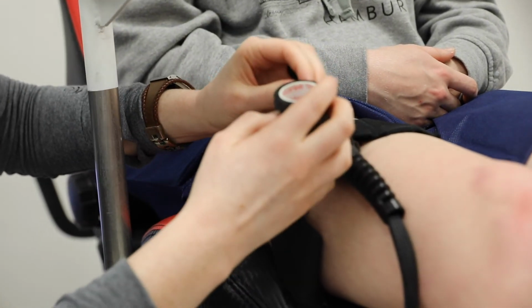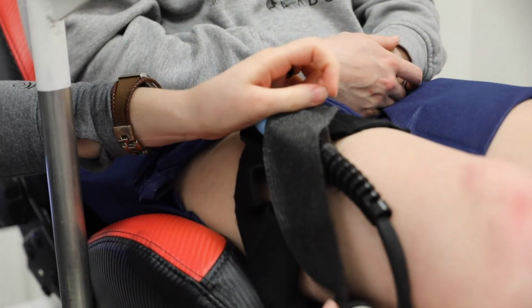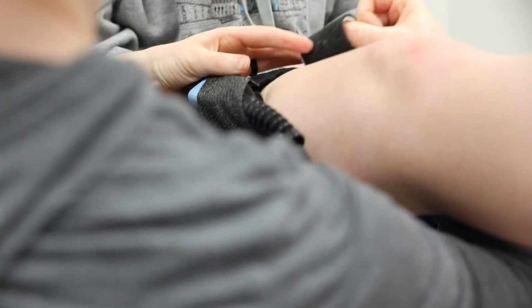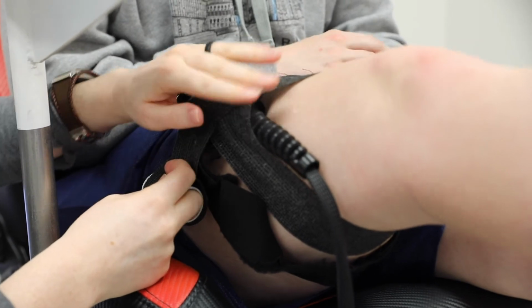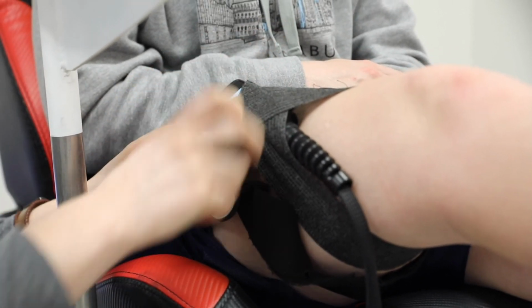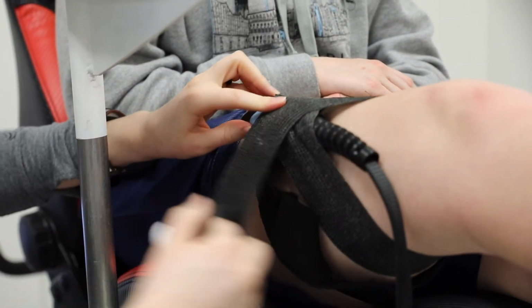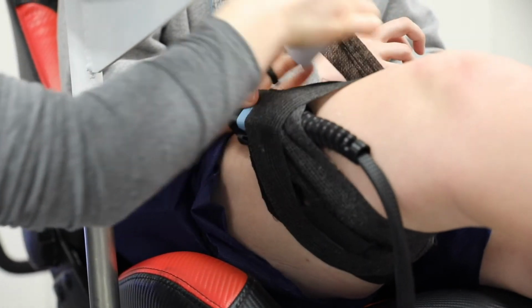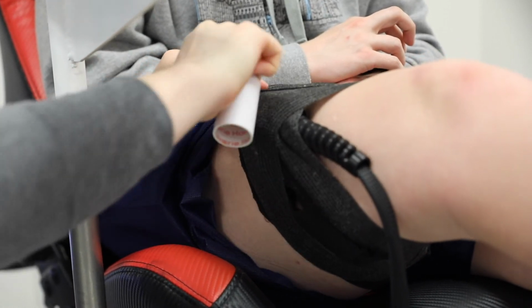So this is the conform tape. Then we're going to hold this in place. We're going to have them lift their leg again. And we're just going to keep wrapping this around until it covers the whole probe, so it keeps it from getting any light from the ceiling lights. So I'm just going to do this little data reading. Yours taped up.